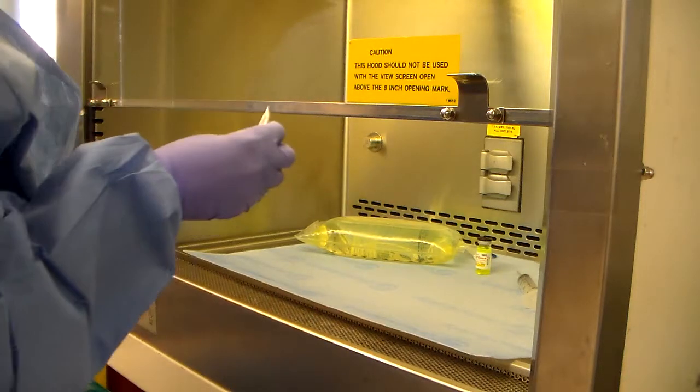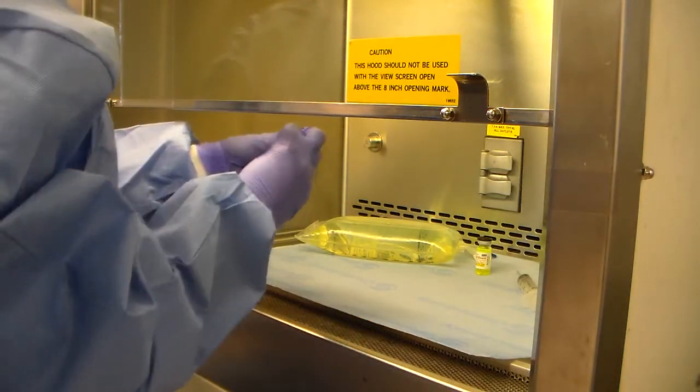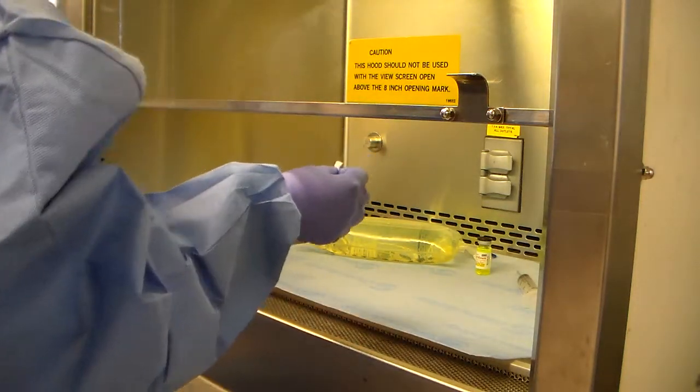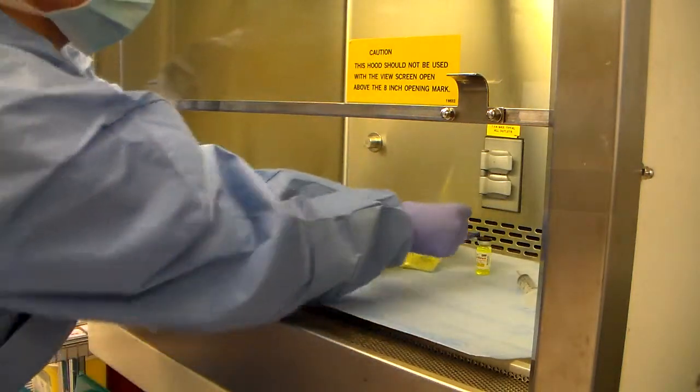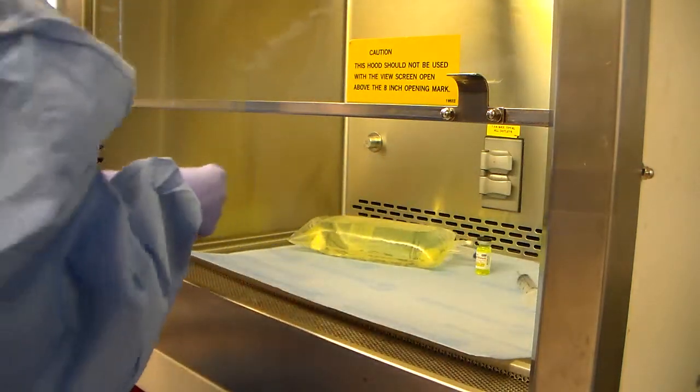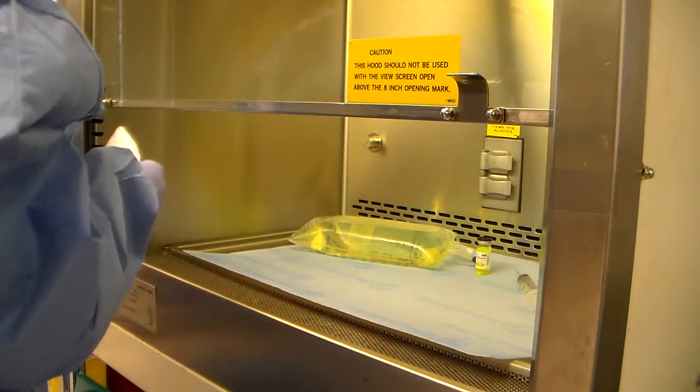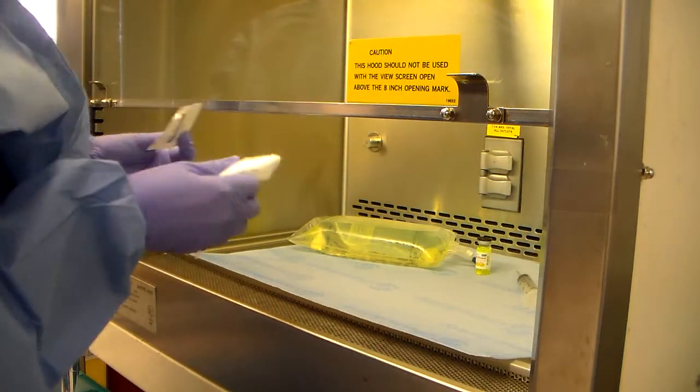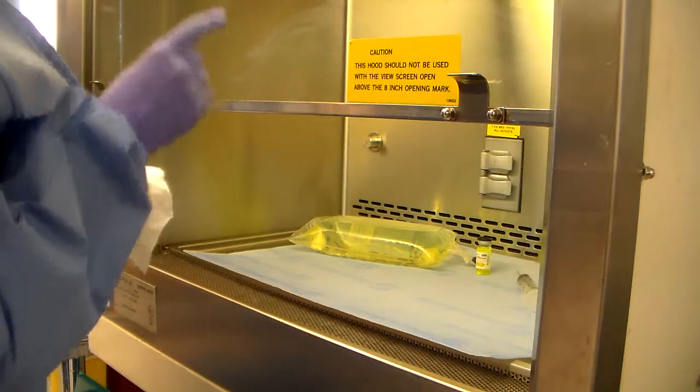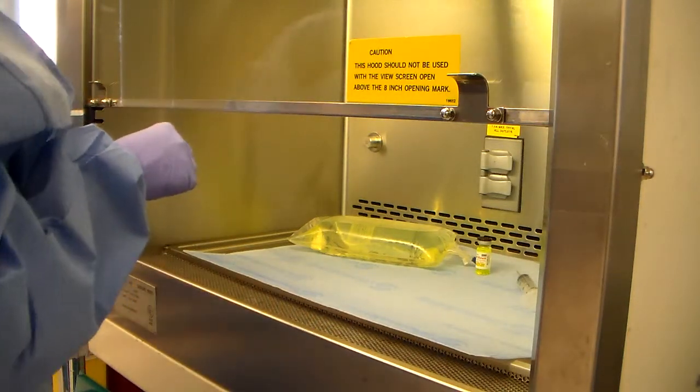The next thing is this alcohol pad. I'm going to clean the white IV port. Next alcohol pad will be for the top of my hazardous vial.